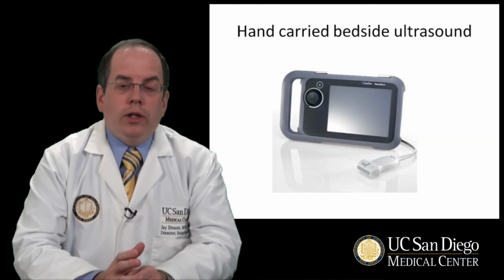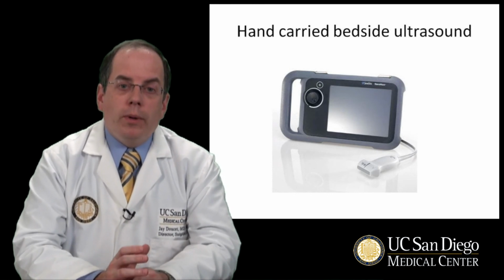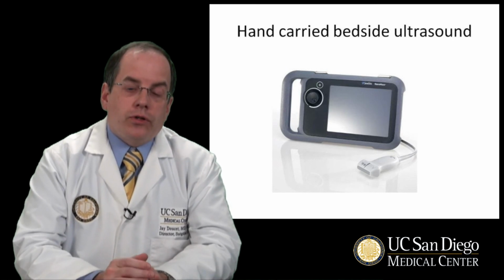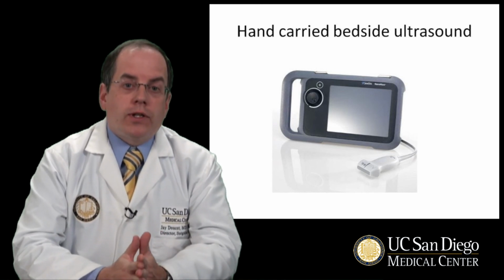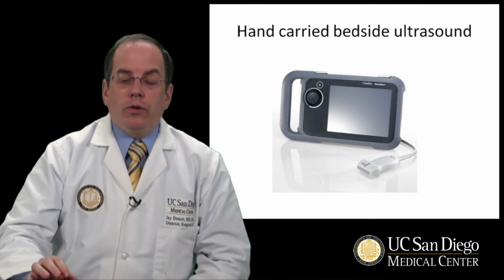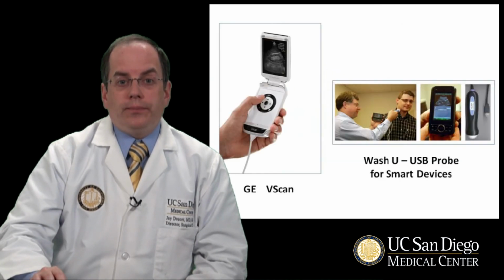A revolution in the size and technology of ultrasound is upon us, and machines are now becoming smaller and less expensive. Handheld ultrasound machines, which can be carried literally around the neck or in the pocket like a stethoscope, have descended below $10,000 in price. These machines may have great utility in rapid assessment at the bedside of the surgical patient.